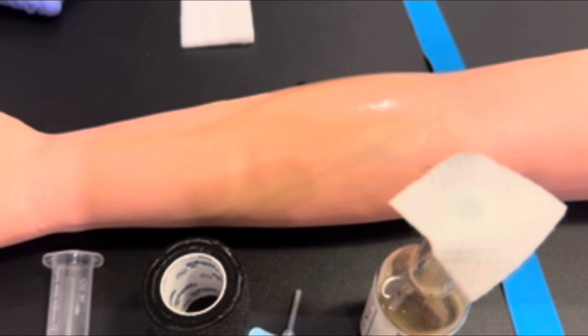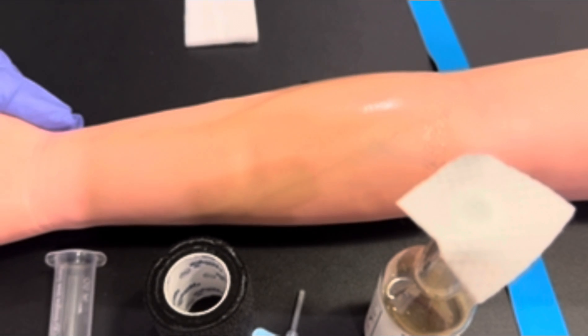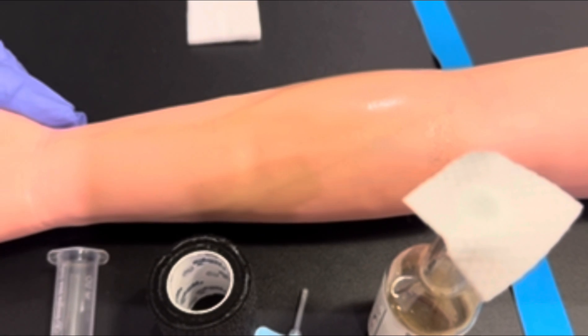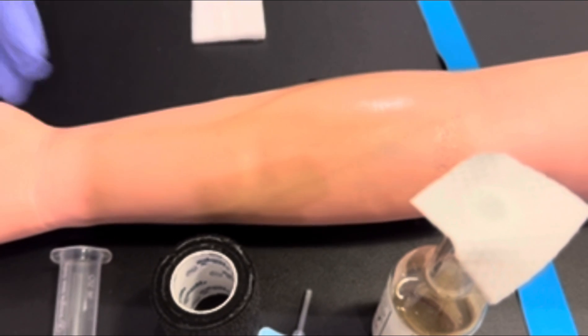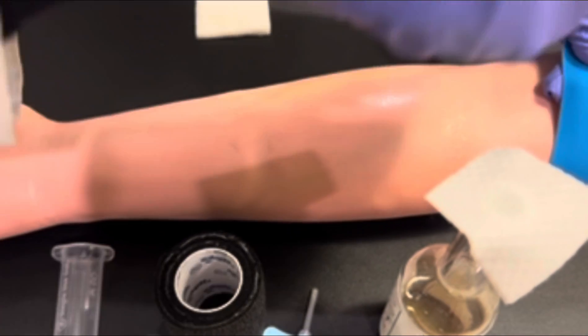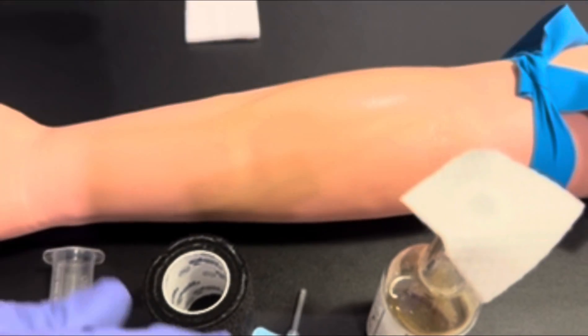The gloves that we are wearing are examination gloves. They are not sterile gloves. So if you were to repalpate that site, you would contaminate the site, which means that you would have to prep and clean the venipuncture site again with 70% alcohol and the chlorhexidine.